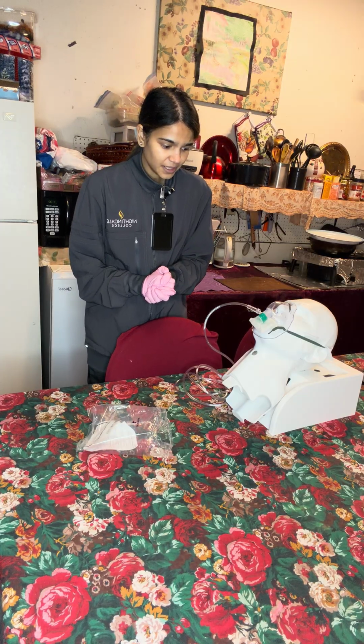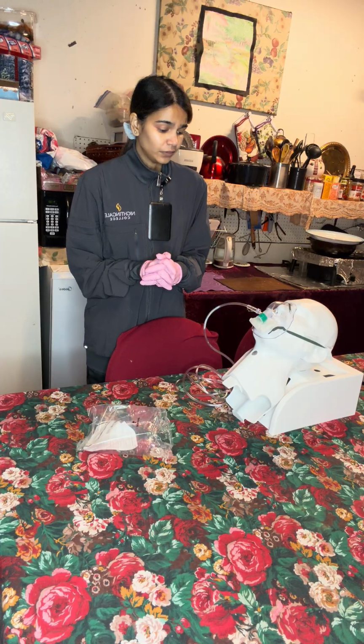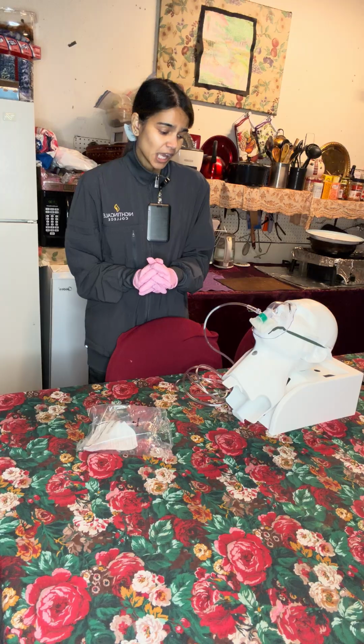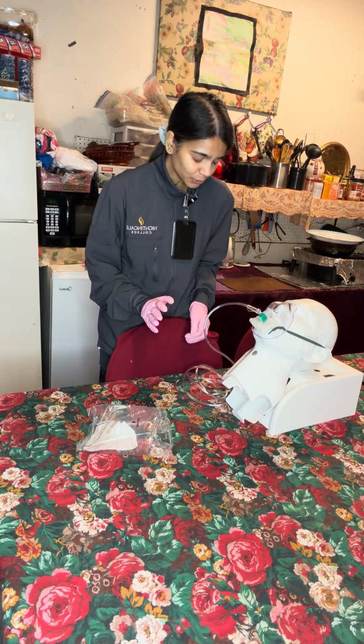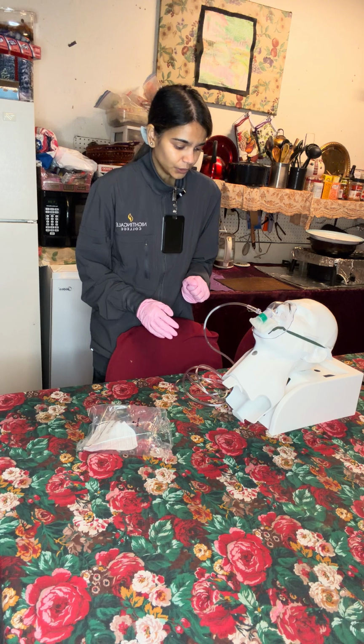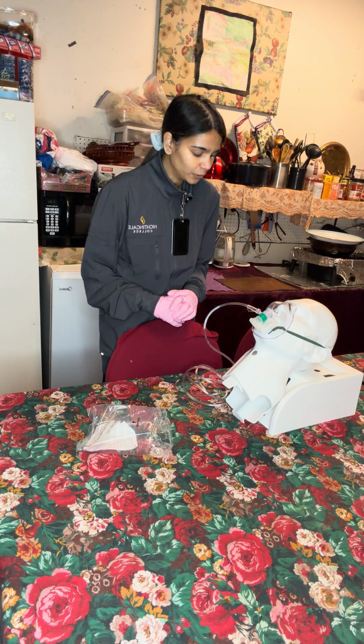Now that the oxygen therapy has been completed, the doctor has ordered discontinuation. I'll let the patient know. The doctor has ordered you to discontinue your oxygen therapy as your oxygen levels have reached normal ranges.